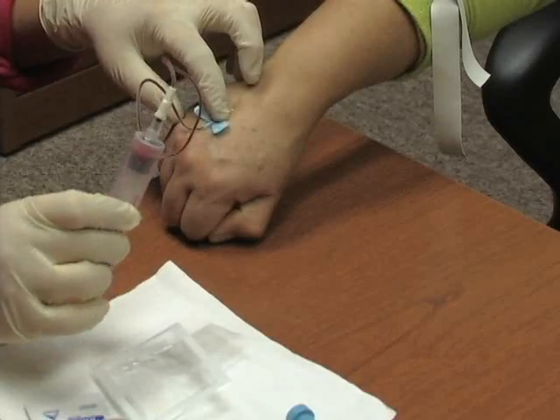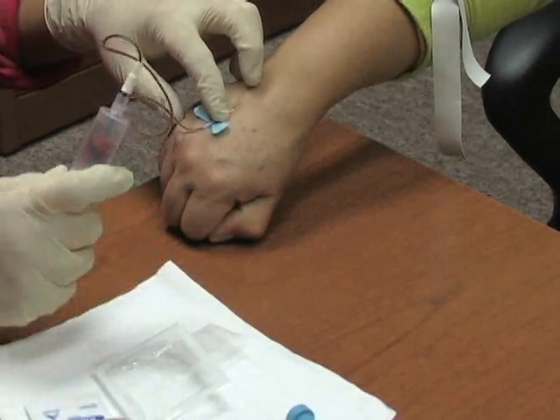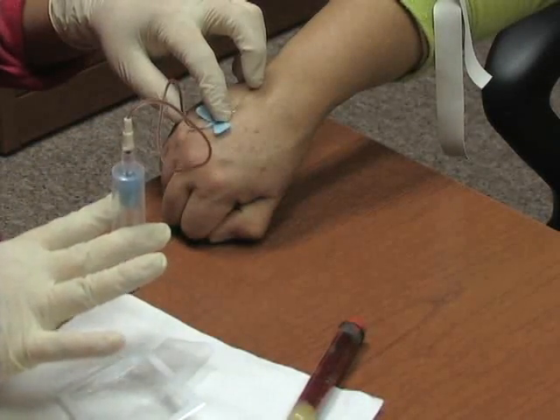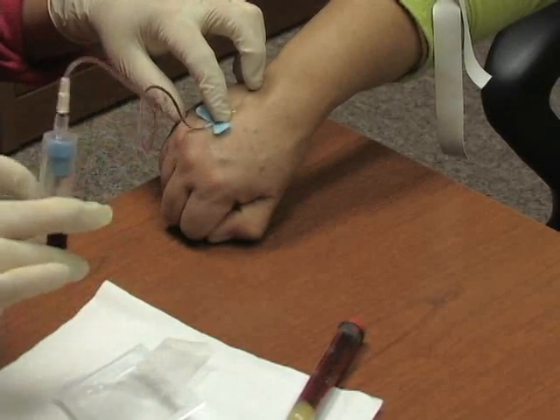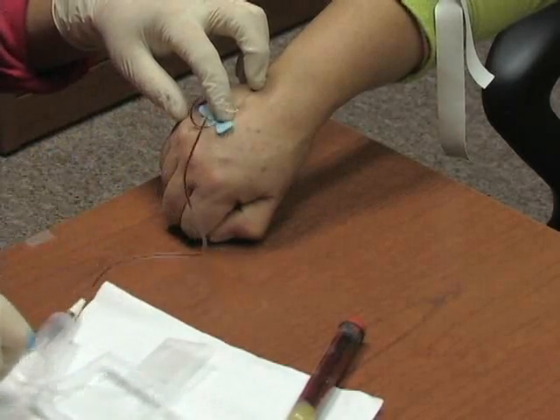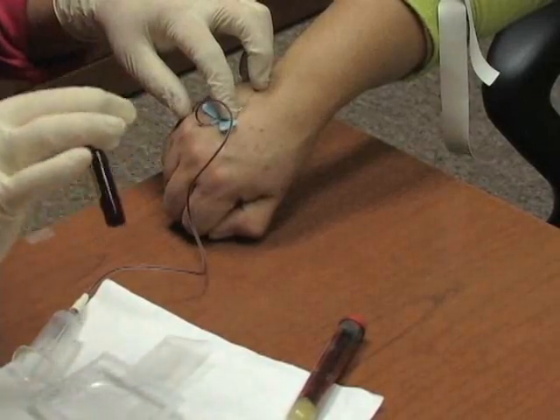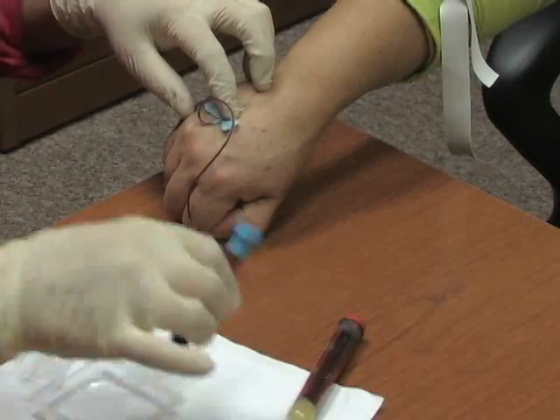You need a couple of cc's for a CMP or most of your chemistries — mostly you don't have to fill the entire tube. You can remove that and place your next tube on. If you draw a PT/INR with a butterfly, you need to fill another tube first. The theory is — and actually what happens — is you can displace the amount of air in your tube with the air that's in the butterfly tubing, which means you won't have enough blood in your tube to have the test run properly.